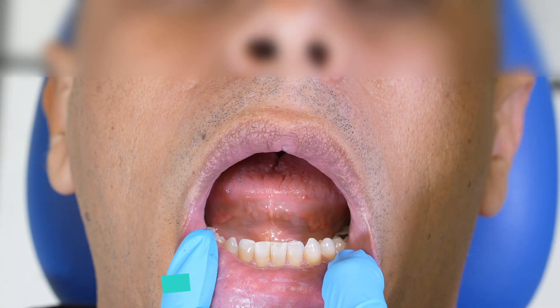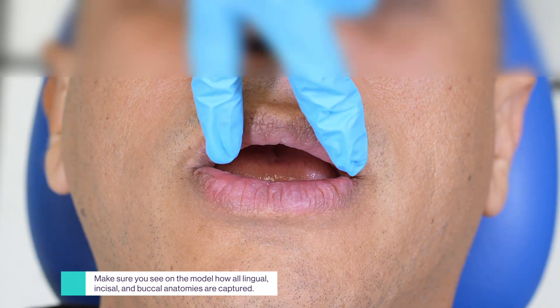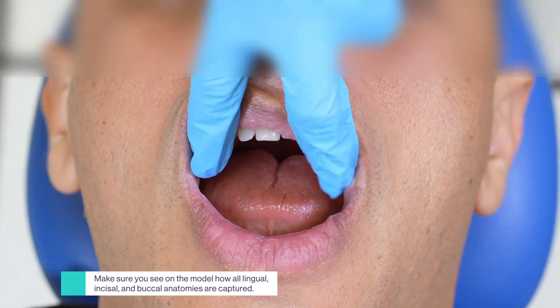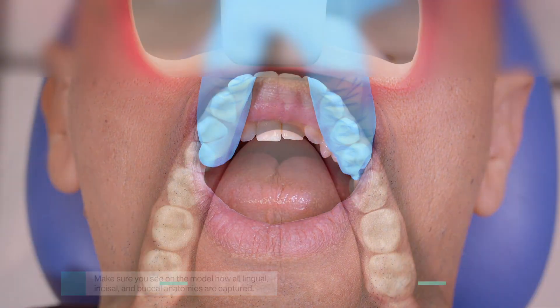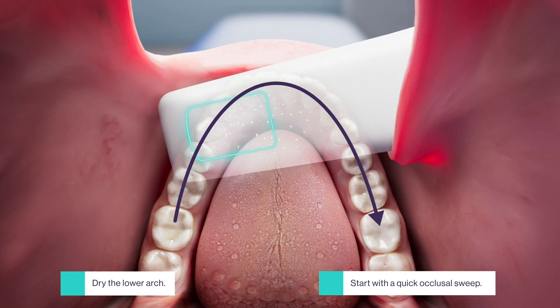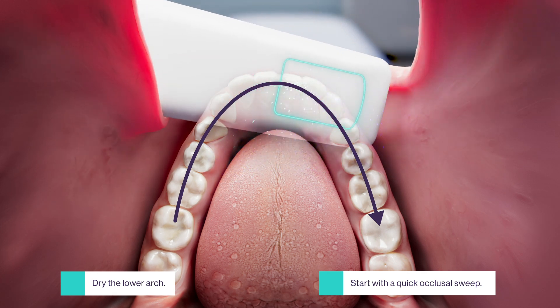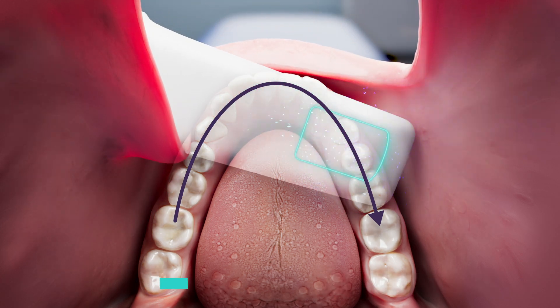To capture the incisal and labial of the anterior teeth, retract the lip in a U-shape with your fingers and follow the arch to get the anatomy. Start with the lower jaw. A quick occlusal sweep ensures seamless stitching. Hold the wand straight back and angulate it towards the opposite side of the arch, hovering above the occlusal surfaces.